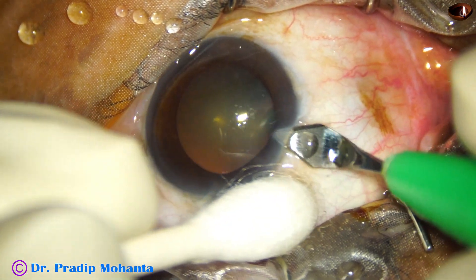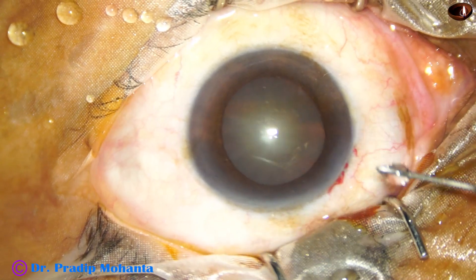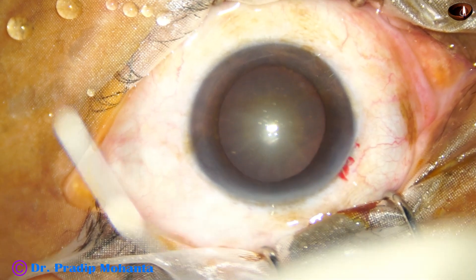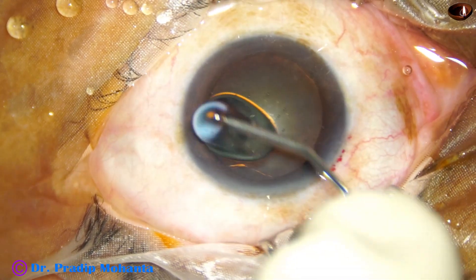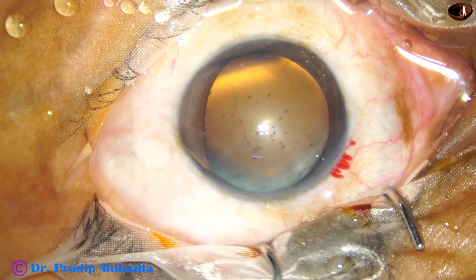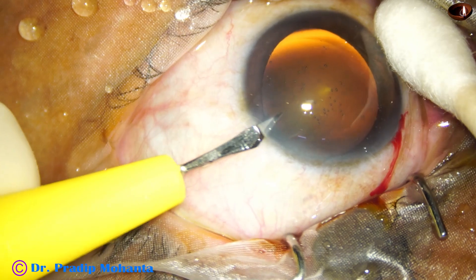Dr. Neto Rosateli is a very respectable name in the ophthalmic world. He is in Brazil and is a very high-volume surgeon. He uses a chopper which is long and round-bodied, and there is a ball at the tip of the chopper. This is a round-bodied, blunt instrument.